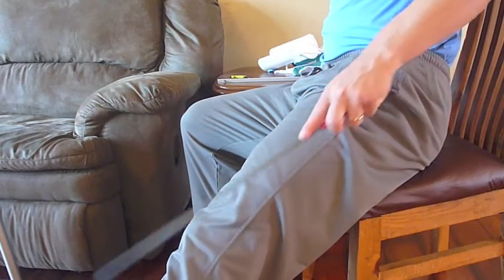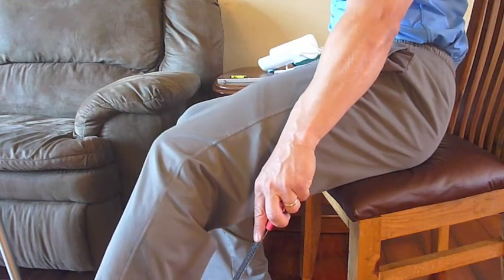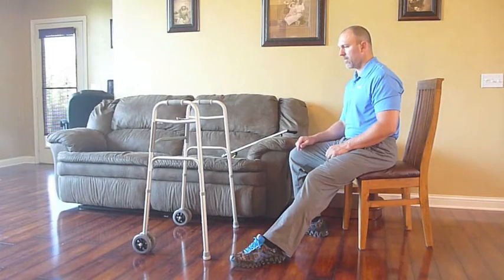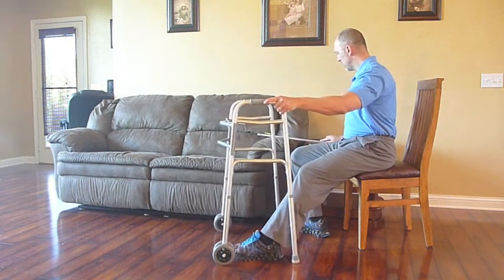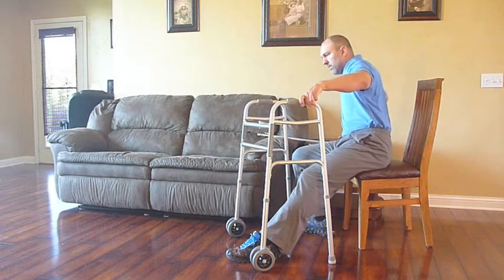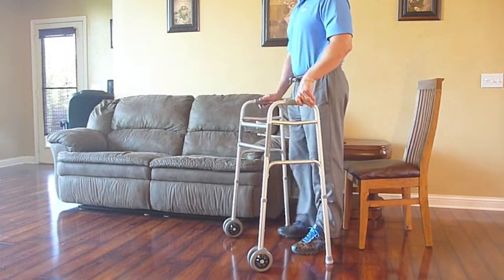Take precaution that when placing the foot in the shoe, you lean back using the shoe horn so as not to bend too far at the hip. Once again, when it's time to stand, you can use your reacher to grab your walker. And if you have the option of using a chair with handles, that would be best. If not, use the strength in your arm and your uninjured leg to stand.